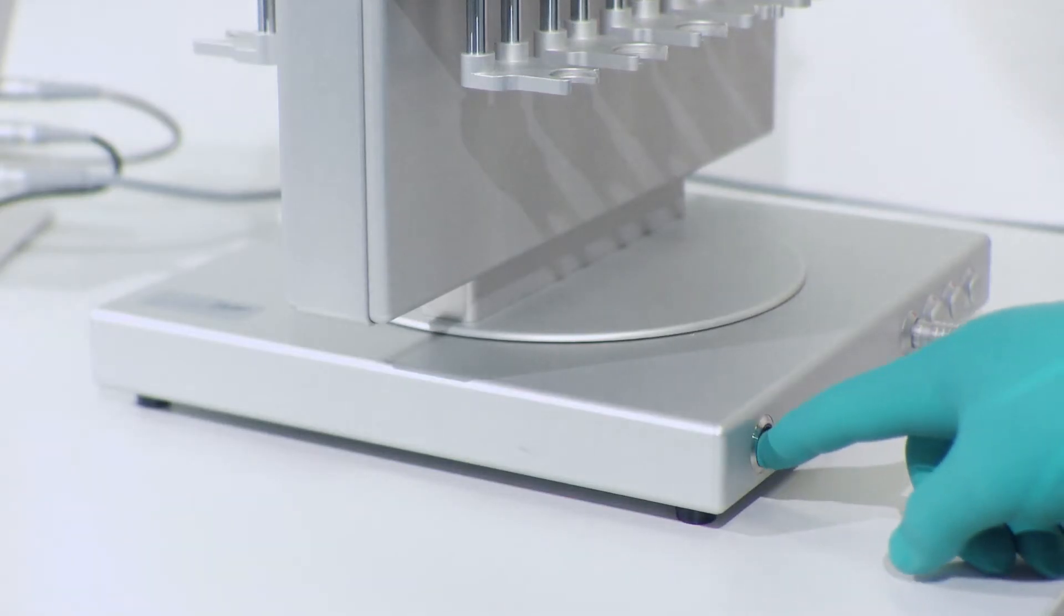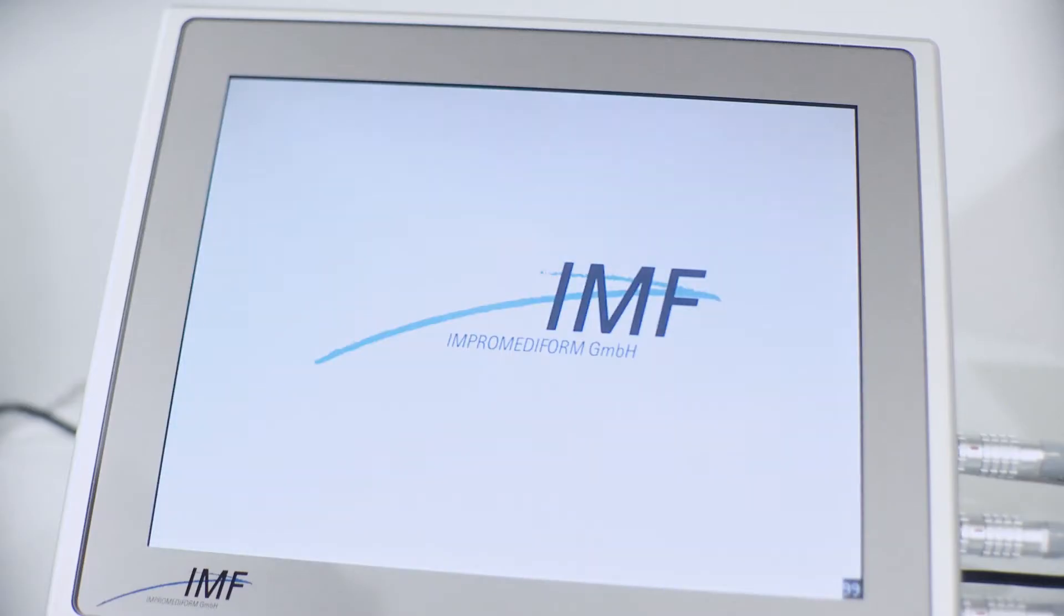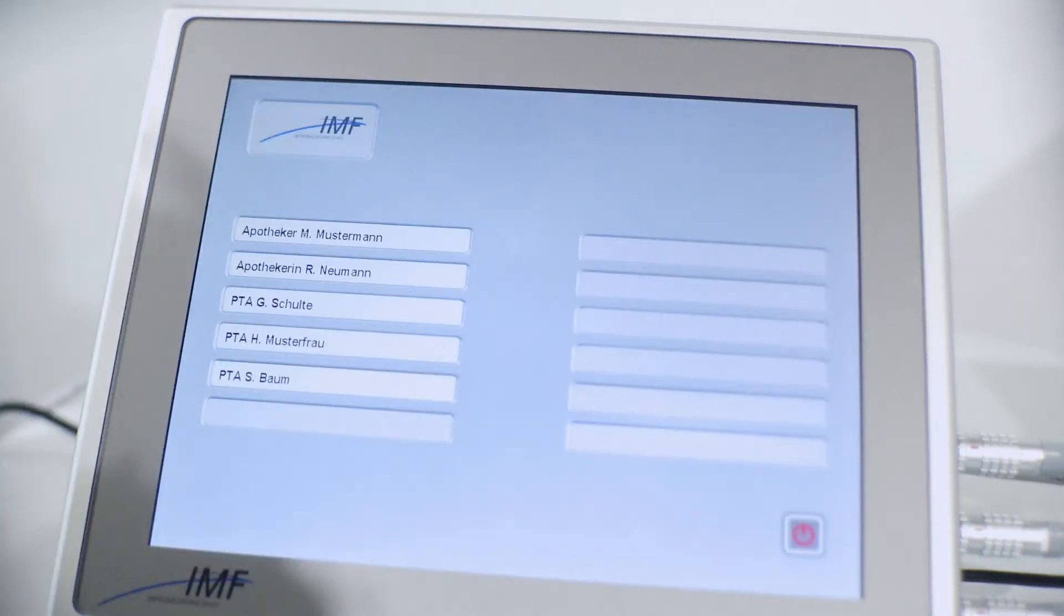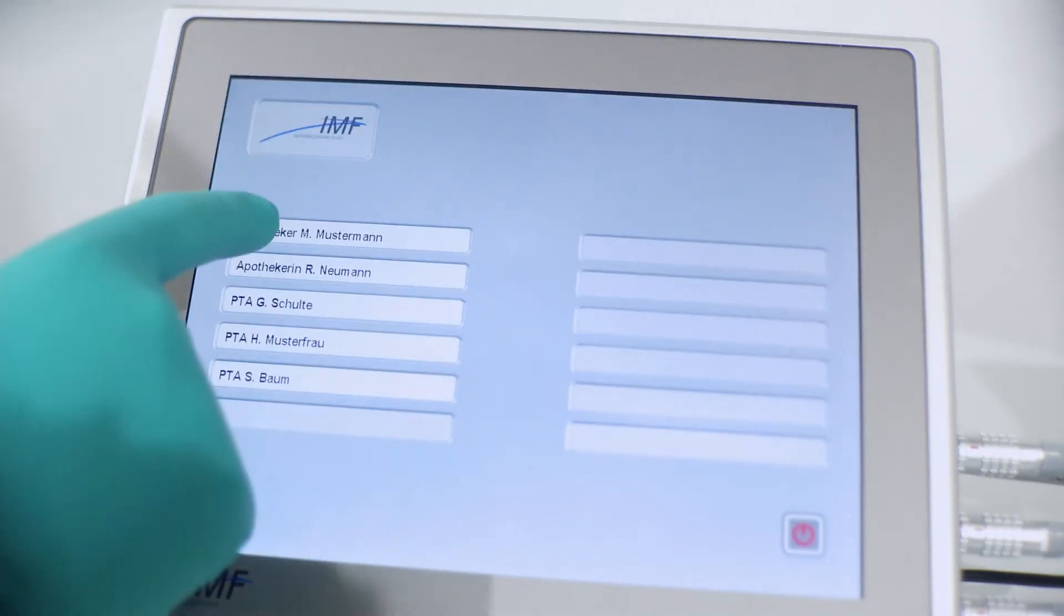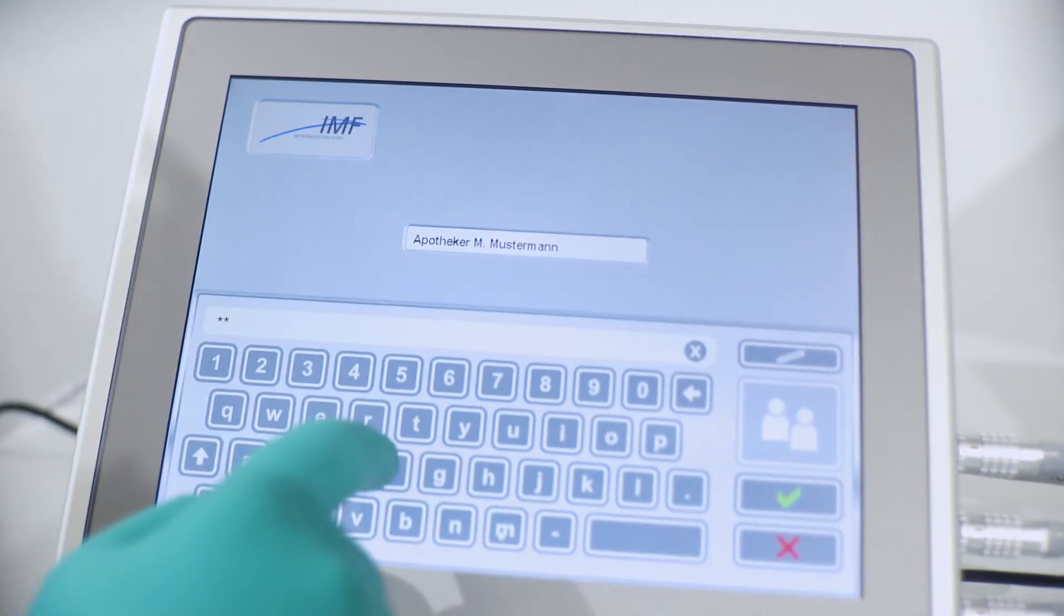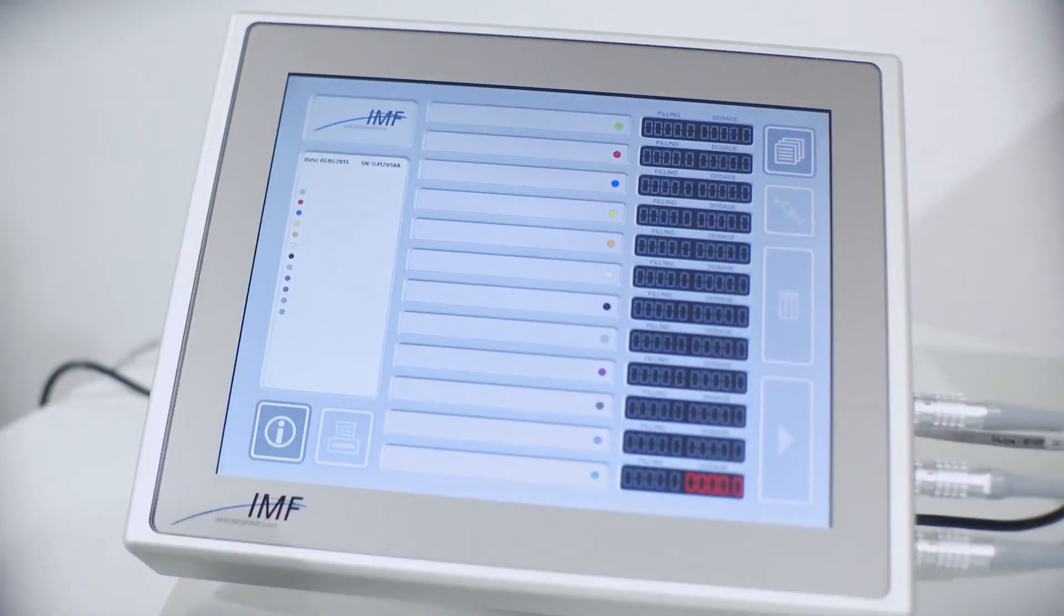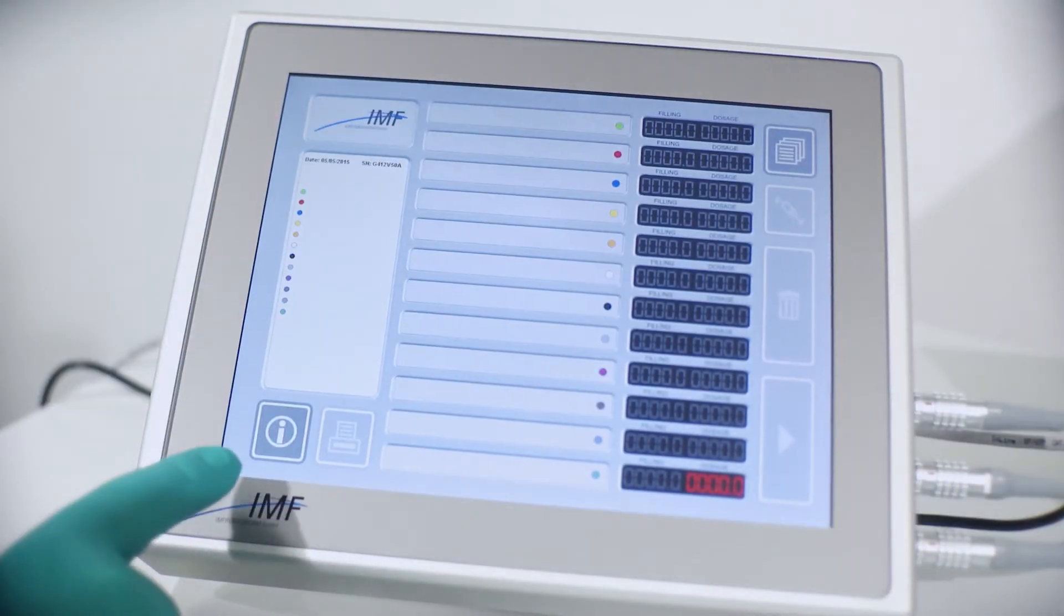To start the compounder simply press the power button. The IMF logo will light up and so will the touchscreen. Once the starting process is completed the touchscreen will pop up with a login page information. Each username is password protected. There are preset user levels to facilitate the access for basic operators, trained operators and administrators.